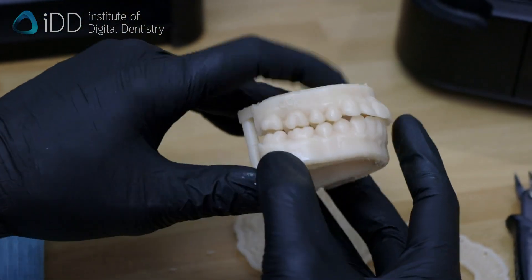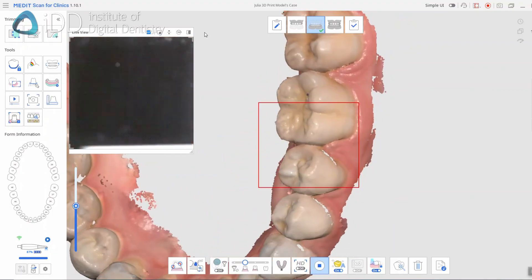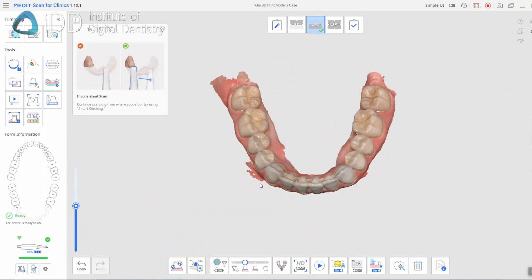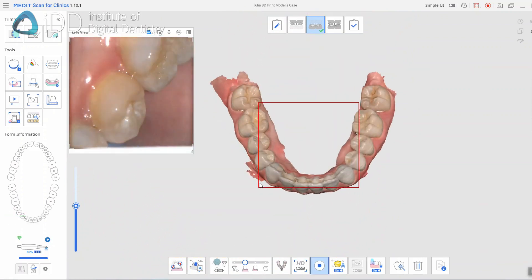Do you want to know how to 3D print models? First, a digital impression of the patient's teeth and gums is taken using an intraoral scanner. Here we use the Medit i700 wireless.